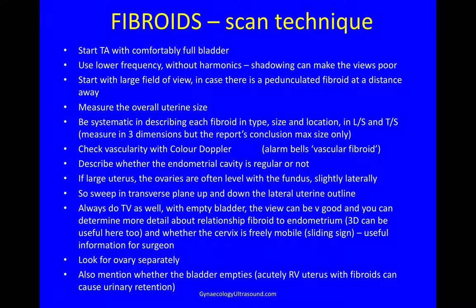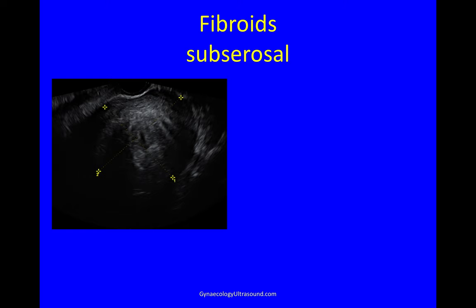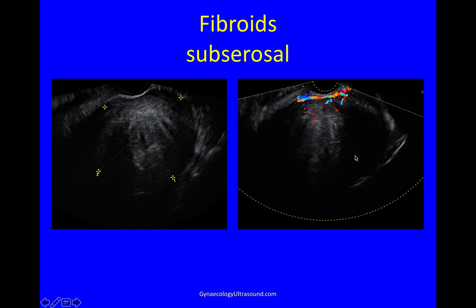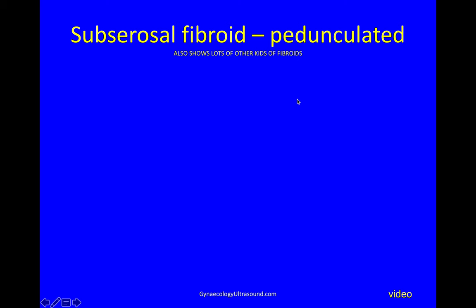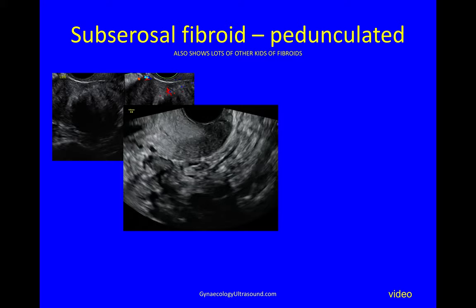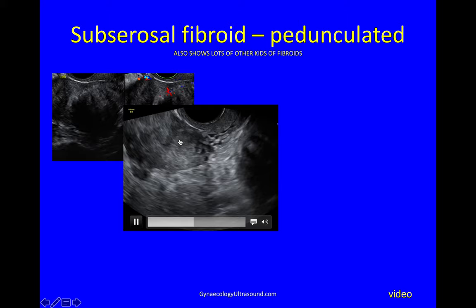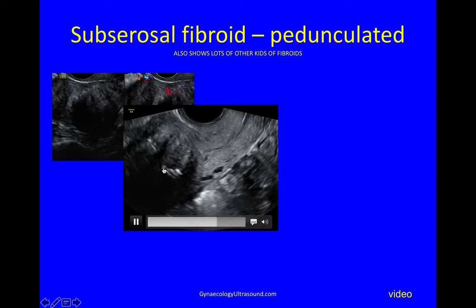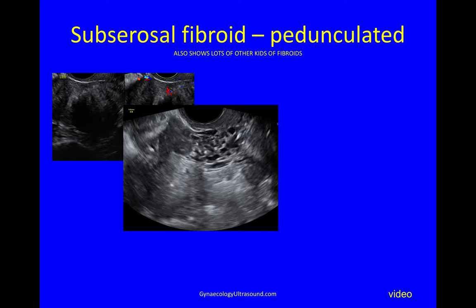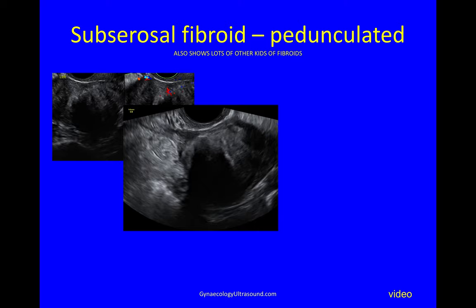Subserosal fibroids can be quite large, demonstrating dense peripheral shadowing and peripheral vascularity only. They can be pedunculated, as in this case. This is an adnexal mass — you can see a round solid mass — but then scanning in the lateral longitudinal plane a pedicle appears connecting to the uterus, and you can see lots of other fibroids there: submucosal, intramural and subserosal, they're all visible.